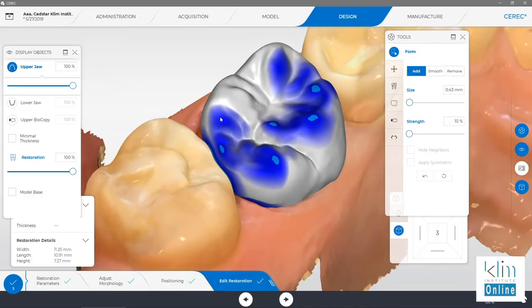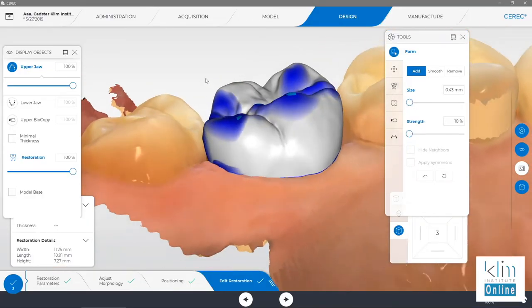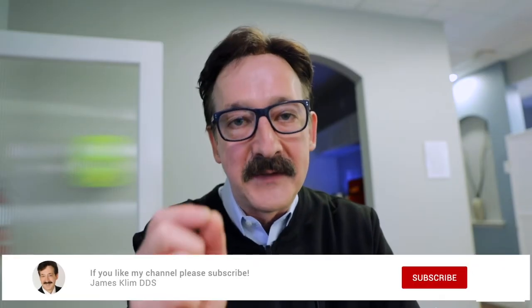Hello friends, welcome to the design screen. I get a lot of questions about which tools to use, what's the order, how do I make that design efficient and get the process done in a reasonable amount of time. And that's what this video is about.